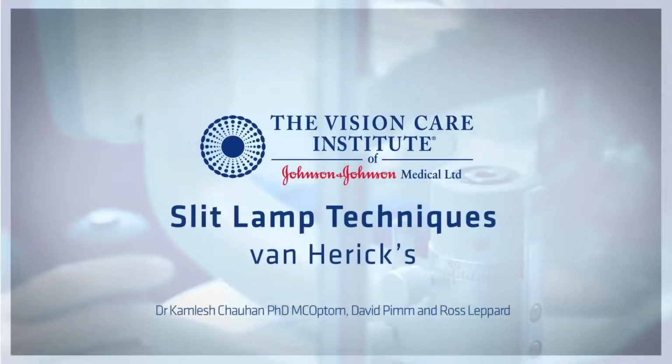Assessing the anterior chamber angle is important in helping to determine if the patient is at risk of angle closure glaucoma, or if angle closure glaucoma might be induced by pupil dilation. A common technique to assess the anterior chamber angle is Van Herick's. It is frequently performed prior to pupil dilation to determine if angle closure is probable.